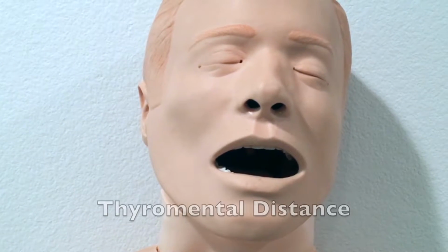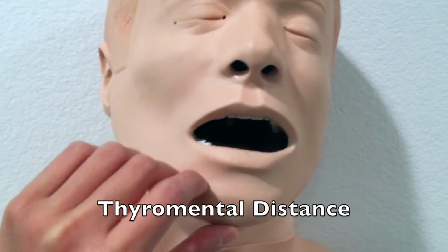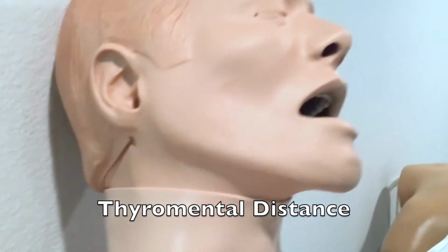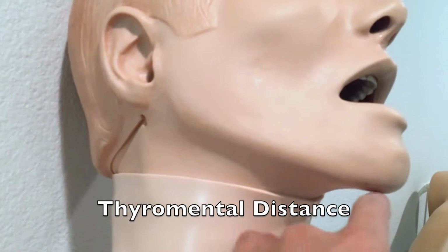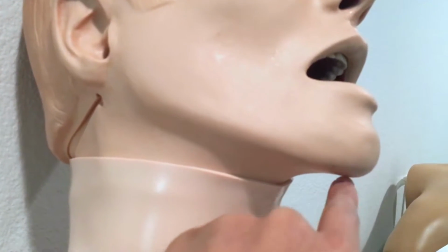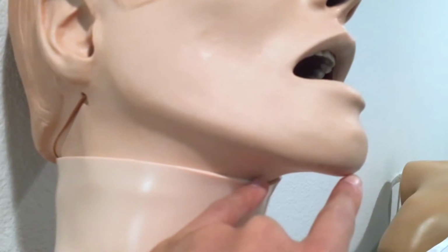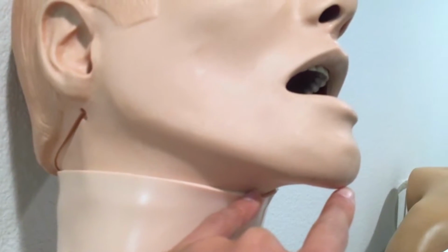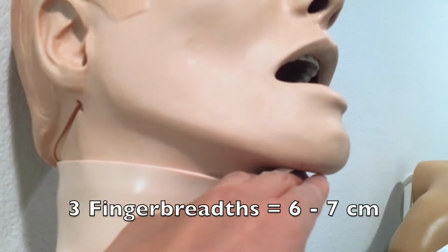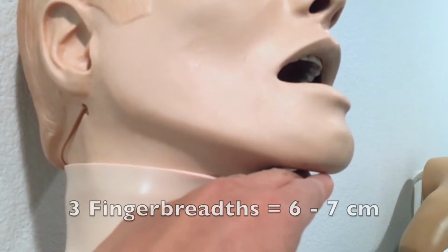We also want to check the thyromental distance. That's basically the distance from the chin, I should probably go on the side, basically from the chin to the thyroid cartilage. So thyromental distance: thyroid to the chin, which is mental. And we want it to be about 3 finger breadths, which is about 6 to 7 centimeters.